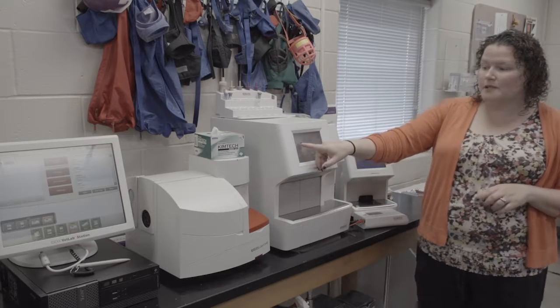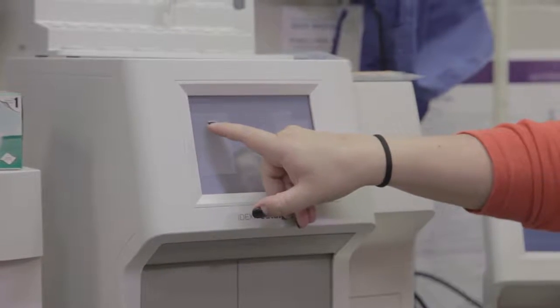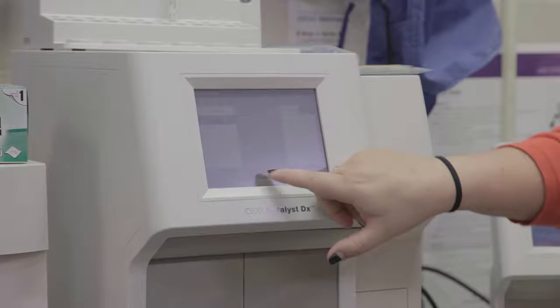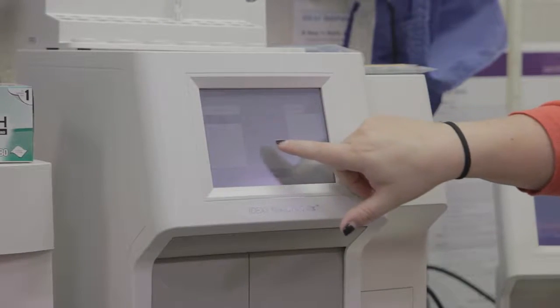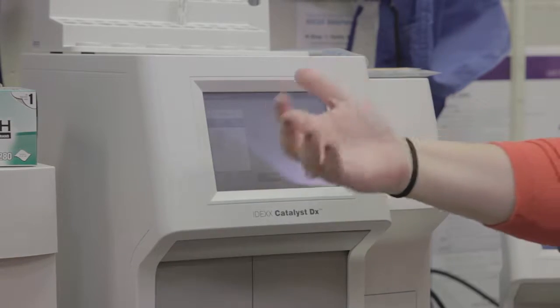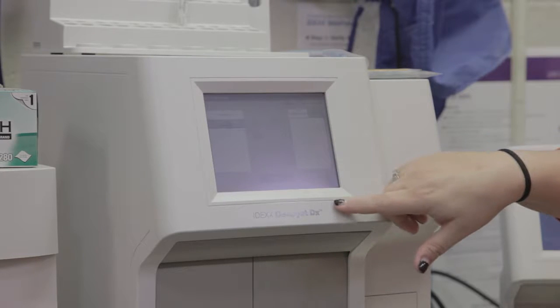Okay, so you notice that our patient is hanging out on the pending list here. So I'm going to choose my patient, and this touchscreen likes a little bit more of an actual touch, like a firmer touch. I'm going to verify that that's the patient, so all of my patient information will be here. And you could have multiple patients ordered up waiting to be ran on this analyzer. So I'm going to choose select.